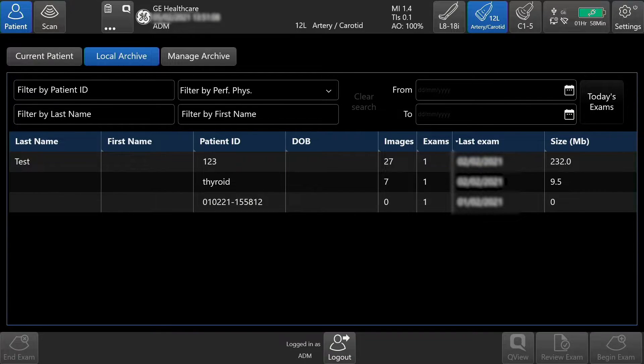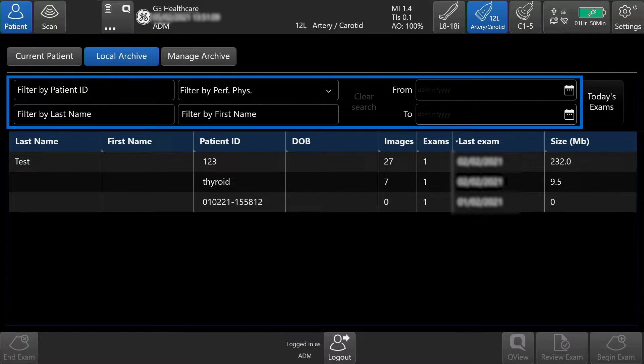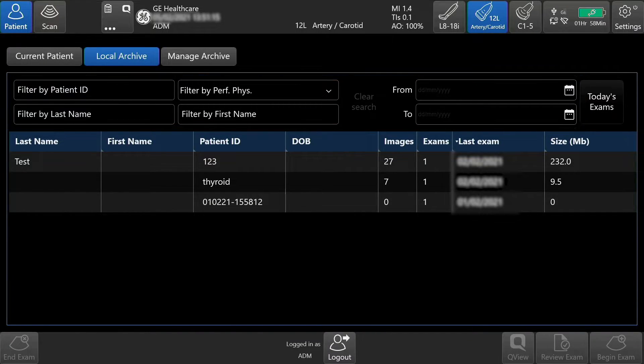To search for exams, you can filter by patient ID, first and last name, performing physician, and exam date, all located on the top of the touch screen.